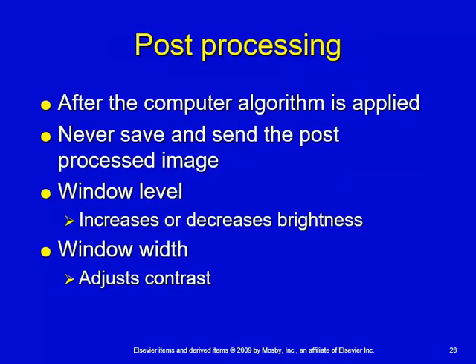What we have in the image display after the computer algorithm is applied, that process is what we call automatic rescaling. So you make your exposure, and you've got the stored histogram, which is your lookup table inside of the computer. Your computer seeks to make your image look like the stored histogram as far as the contrast and density go.